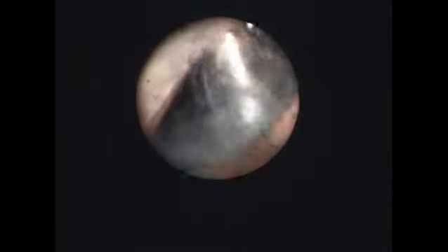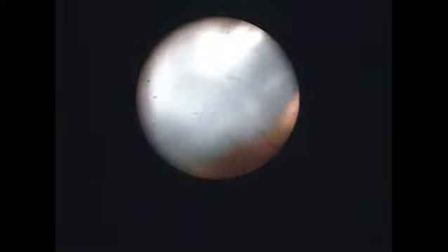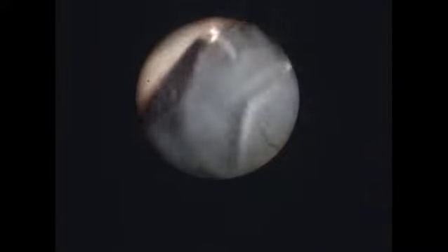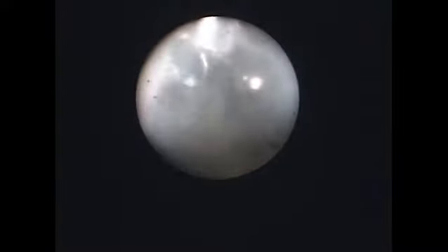The phacochop technique and Nagahara chopper movements employed to break down fragments that occupy a major portion of the anterior chamber pose a risk of endothelial touch. After breaking the nucleus, fragments were observed to be moving at much greater speed in comparison to the view from the microscope and can better be assessed using the endoscope. In terms of followability and holdability, the Osiel probe proved efficient when fragments were very rapidly emulsified.